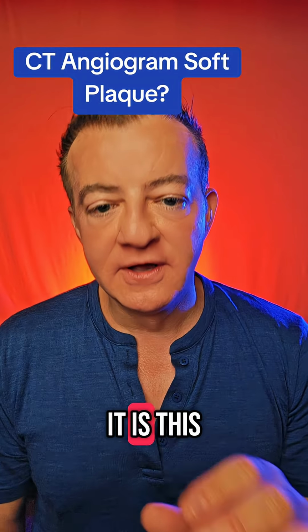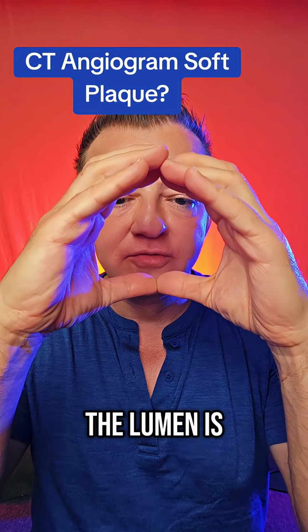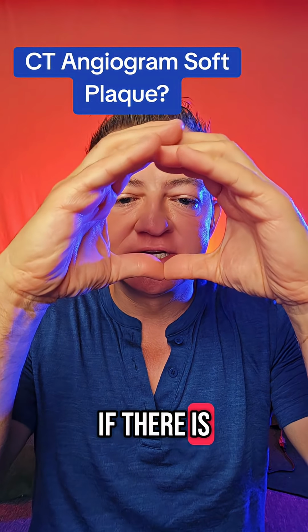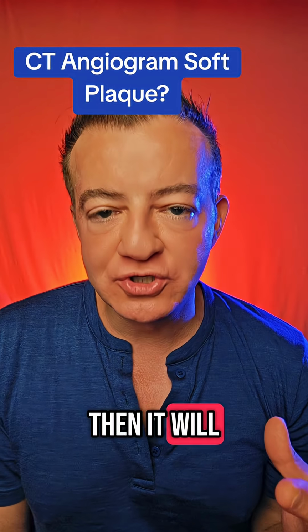So here's what it is. This is the lumen of your artery. We inject dye in here. If the lumen is wide open, you're not going to see any plaque. There's not going to be anything. Soft plaque will be here in the arterial wall. If there is a section where the soft plaque is encroaching on the lumen, then it will show up.